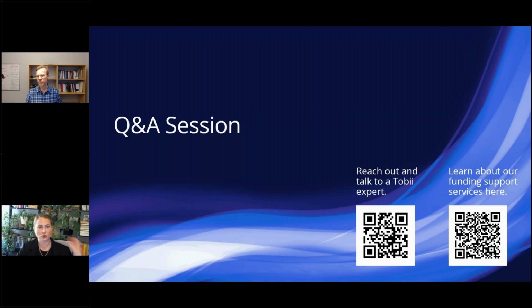So first question for you, Marcus. Can you give some examples of when measuring eye blink dynamics beyond just blink counts and duration could be useful? So some of those amplitude and velocity applications that you discussed. Sure, I mentioned some examples in the beginning, that, for example, in sleepiness research or workload research, the eyelid starts closing a bit more slowly, so everything slows down a bit. So that could be one example of where eyelid velocity would be a relevant measure.